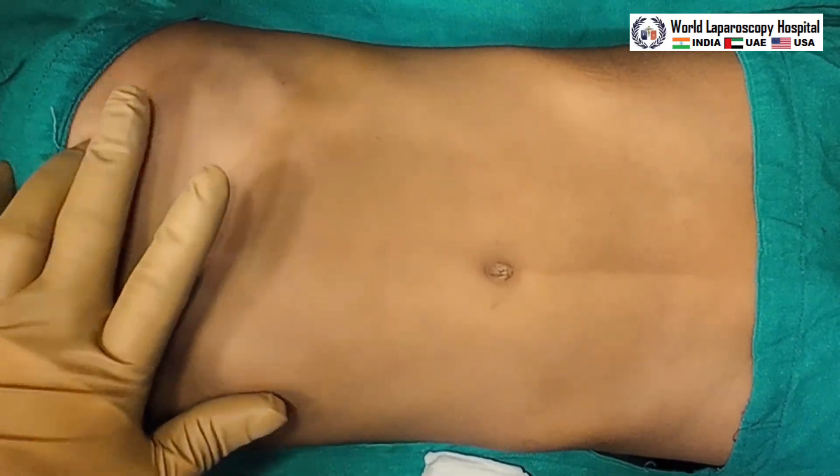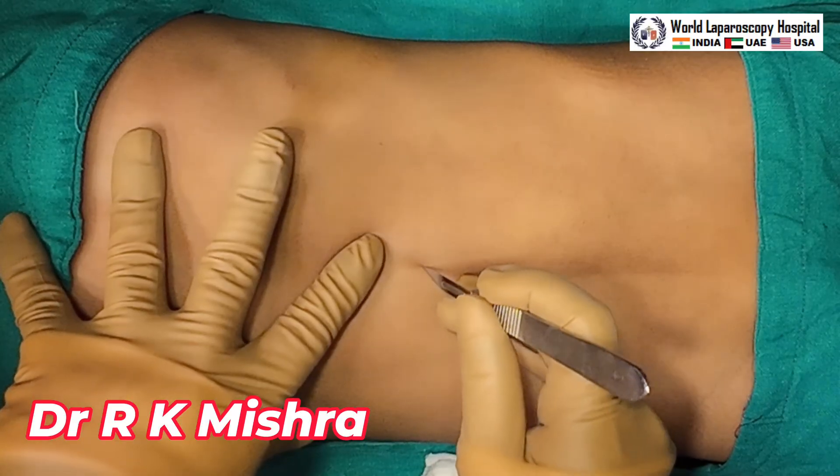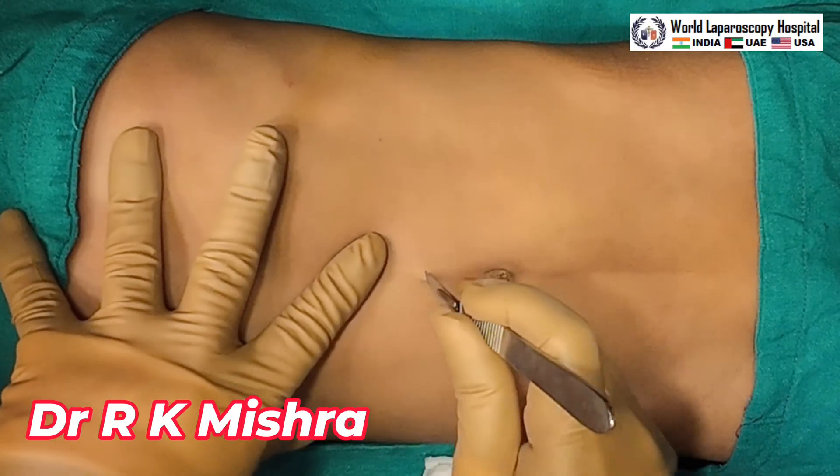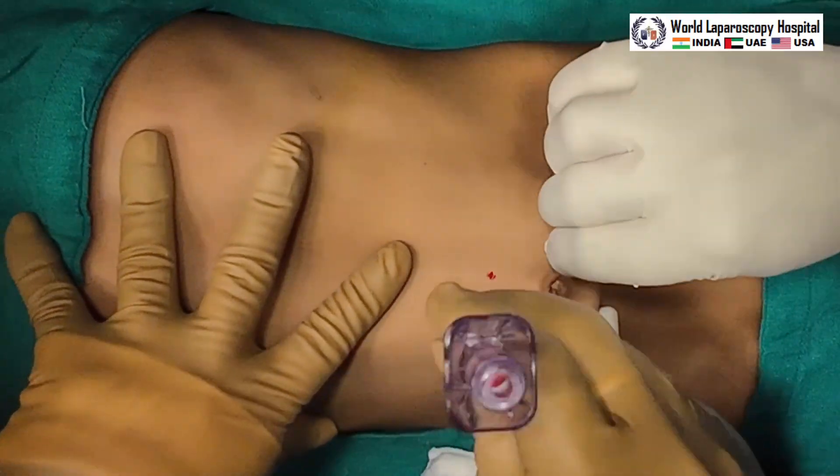Hello friends, this is a case of laparoscopic repair of a small 7-year-old child and we will perform the laparoscopic purse string suturing around the deep ring.